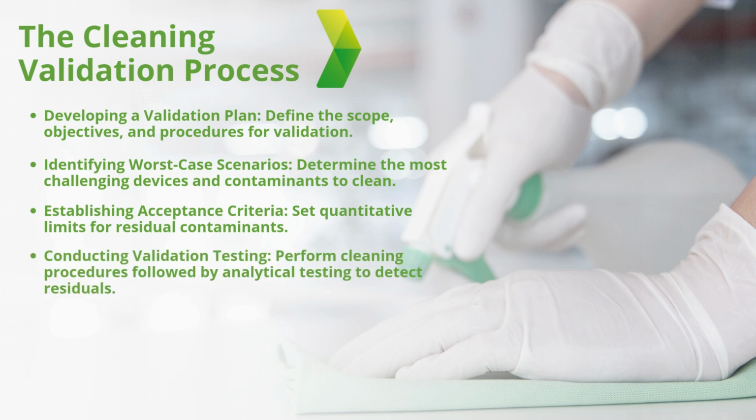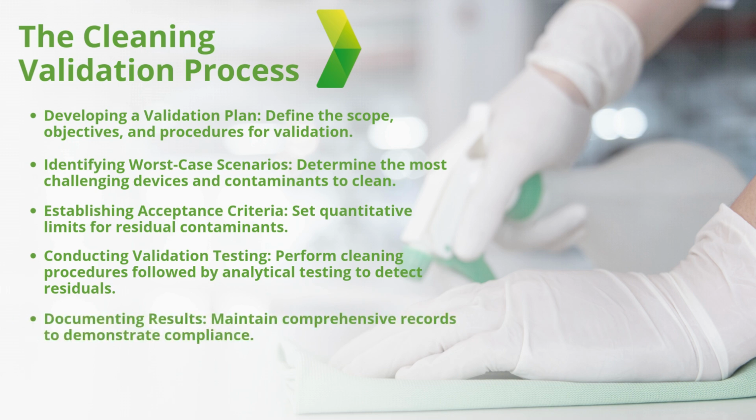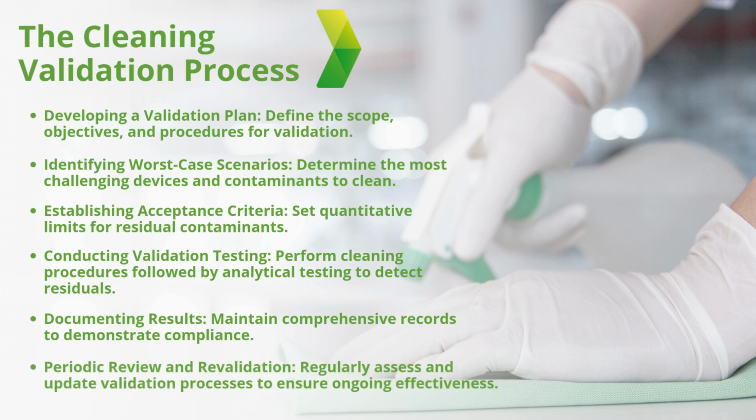4. Conducting validation testing. Perform cleaning procedures followed by analytical testing to detect residuals. 5. Documenting results. Maintain comprehensive records to demonstrate compliance. 6. Periodic review and revalidation. Regularly assess and update validation processes to ensure ongoing effectiveness. Each step is meticulously designed to ensure that cleaning procedures are both effective and reproducible.